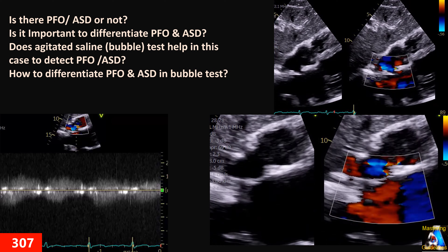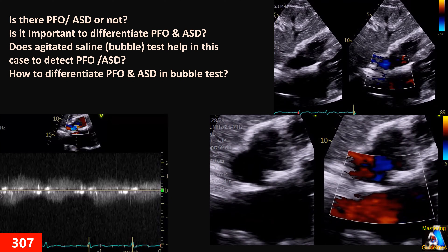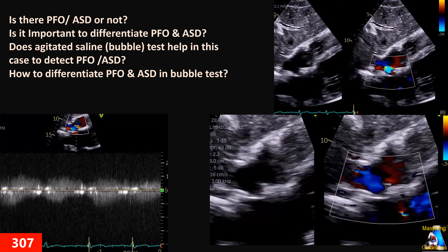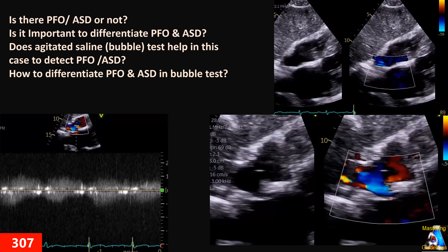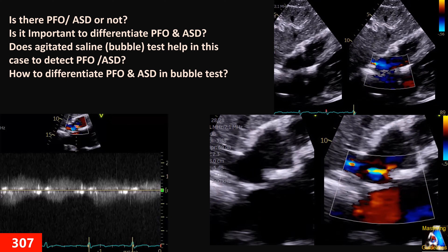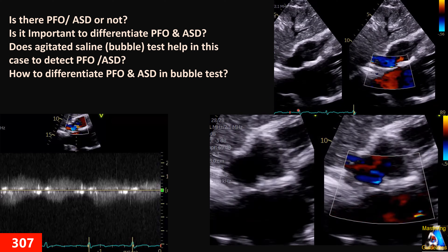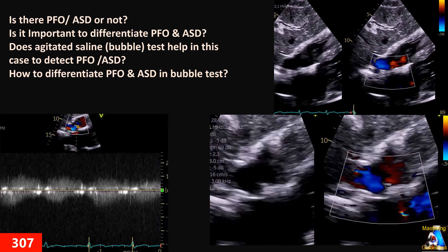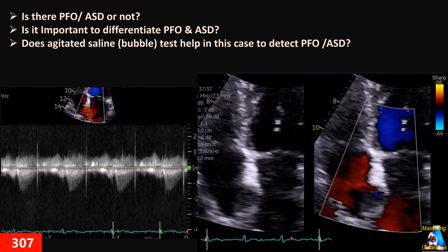First of all, look at these two clips — zoom in, zoom out — and the next slide on apical four-chamber. And Doppler here at this level; exactly, the cursor has been passed through this level. You can see here. Attention to that, and then I am going to ask many important questions. Here, apical four-chamber.